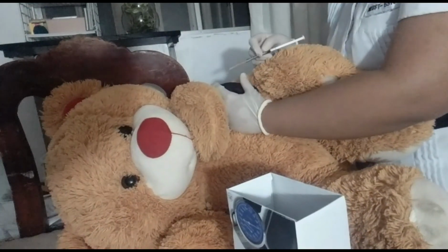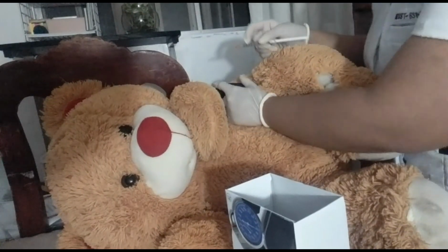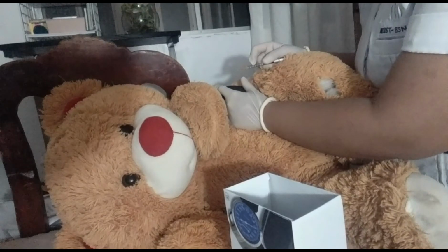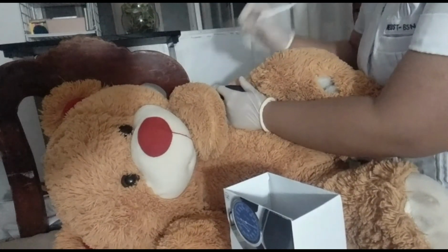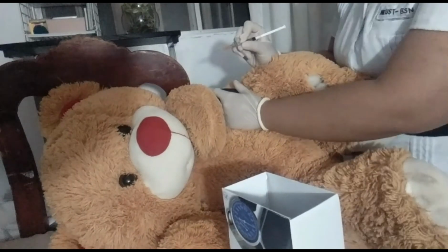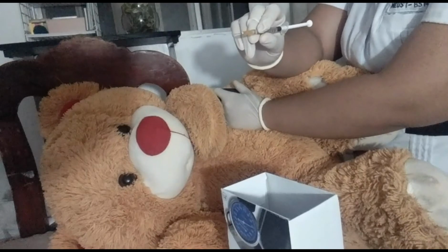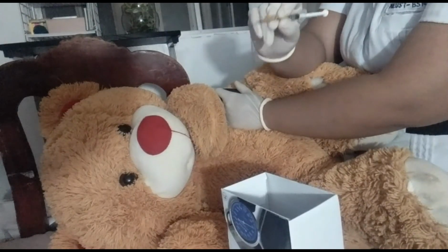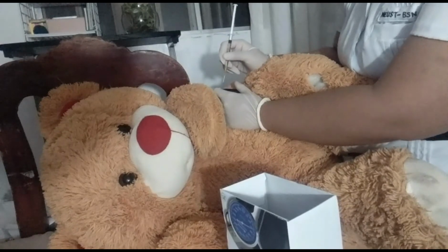Holding the syringe between the thumb and forefinger, as if you are holding a pen, like this. Pierce the skin quickly and smoothly at a 90-degree angle. Insert the needle into the muscle.